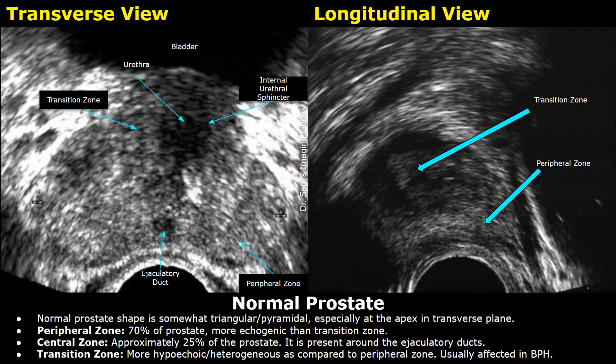Hello everyone, this is Dr. Sam and this video is about benign prostatic hyperplasia on ultrasound. BPH is a common condition in elderly men and is an abnormal enlargement of the prostate. We will be looking at transrectal ultrasound images of the prostate to learn how a normal prostate and an enlarged prostate look in this transrectal view.